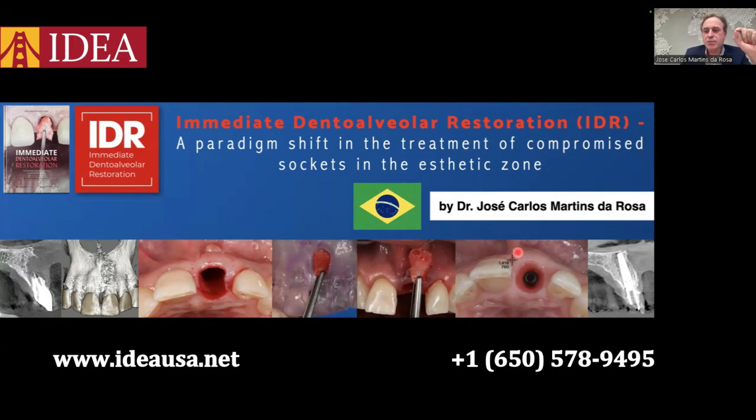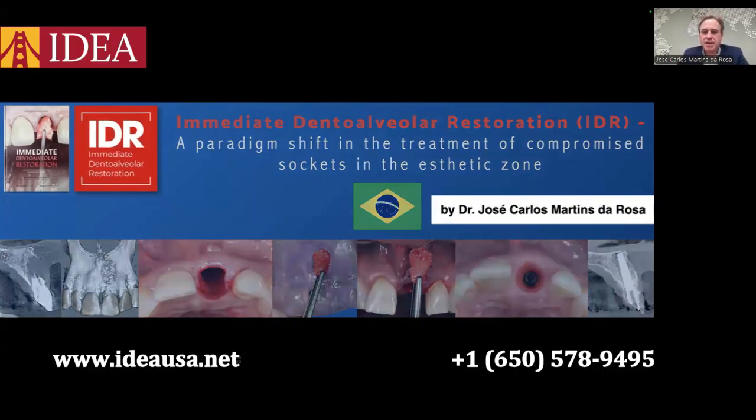And after a couple of months, 3 or 4 months, we may have this kind of outcome, an improvement in the quality and the volume of soft tissue. And you see in the image on the right side, the CBCT scan, the bone graft completely remodeled and still stable. That's the main goal of the IDR technique.